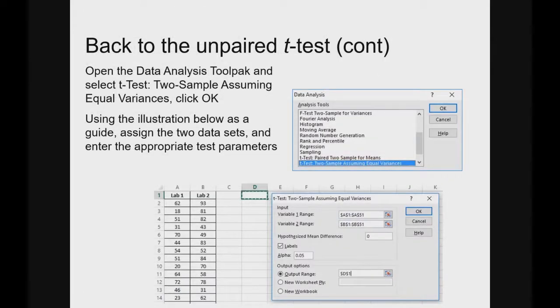So I'm not going to walk through these. I just cribbed these right out of Excel. So all you need to do is go to Excel help how to do this, and it'll walk you through it. It's really pretty straightforward. You can see analysis tool pack. You just check it and run it, and then it's there. And this link actually takes you to another article about how to install it. So then once you install it, it'll be there to use. And it's really handy because it uses that idea of wizards that Excel likes so much, and I do find them very handy to use.